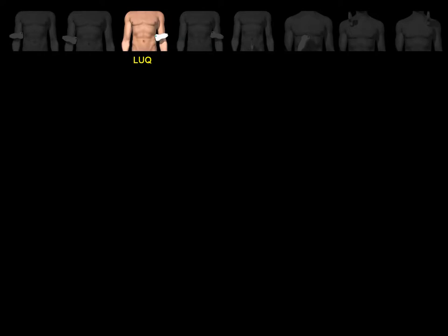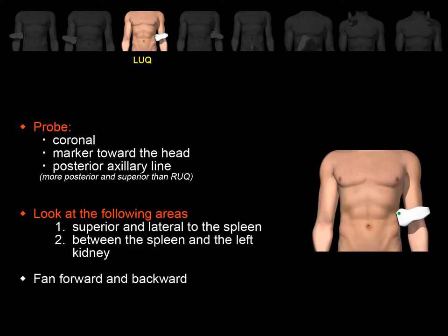The left upper quadrant view is usually more difficult to obtain than the right upper quadrant, because the spleen is a smaller acoustic window than the liver. Place the probe in the coronal orientation with the probe marker towards the patient's head in the posterior axillary line. To avoid rib shadows, slightly rotate the probe to fit in the intercostal space. Look for free fluid superior and lateral to the spleen, and also between the spleen and the left kidney. Fan through these areas anterior to posterior to evaluate the whole anatomical space.